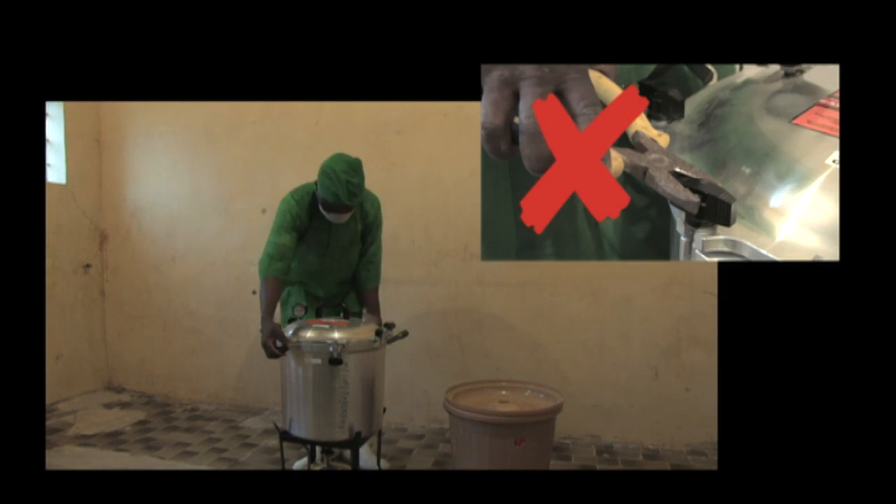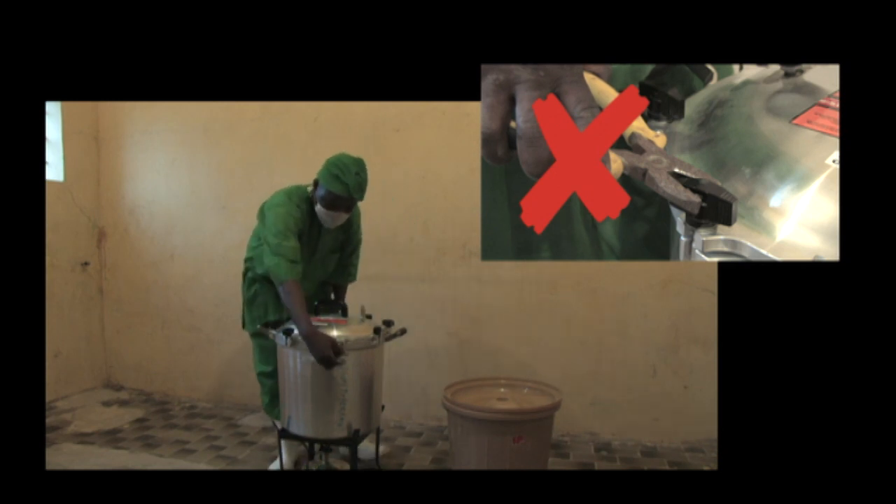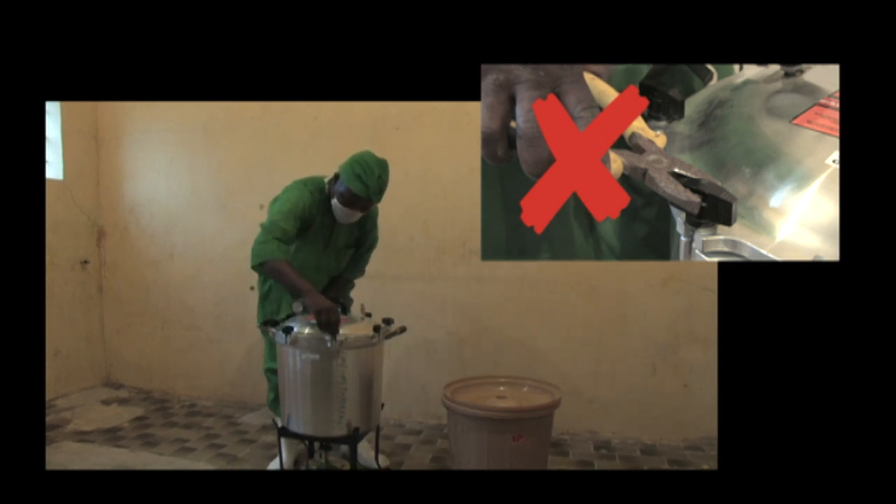Never use a wrench or any mechanical device to tighten the wing nuts. And never hammer or strike the wing nuts or lid when opening or closing.